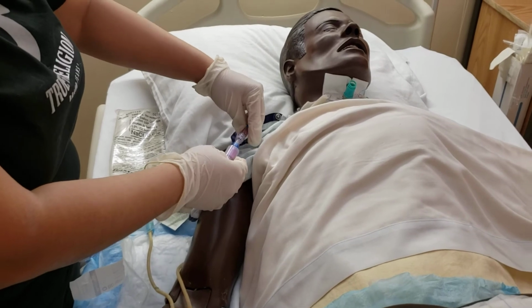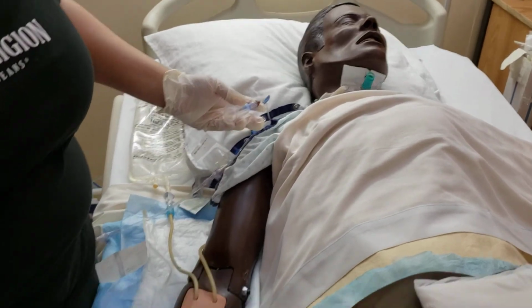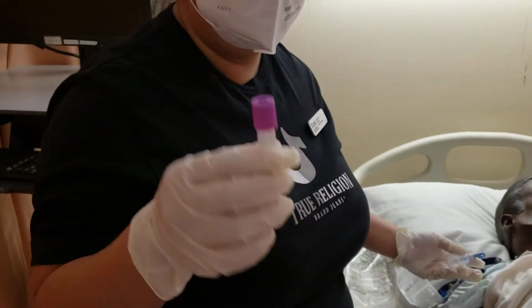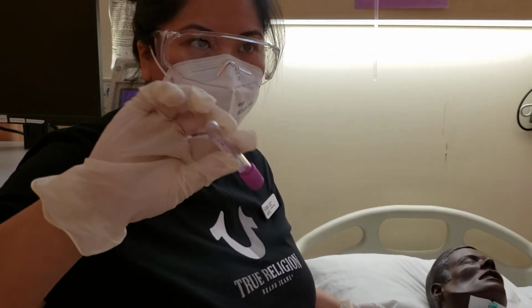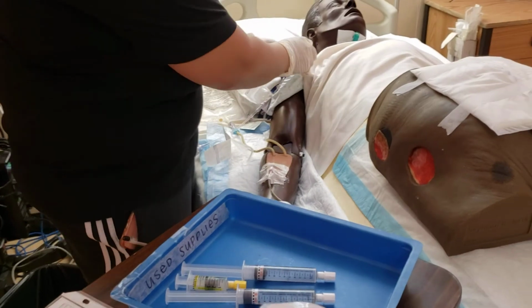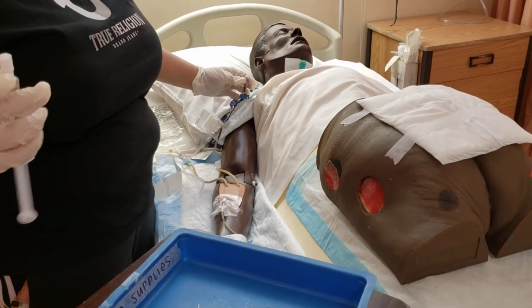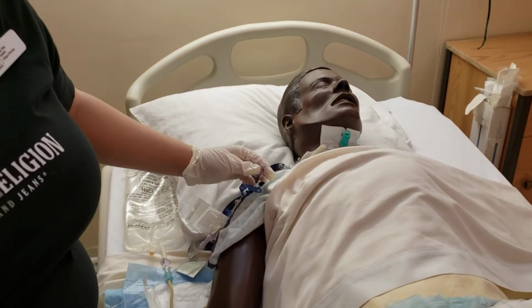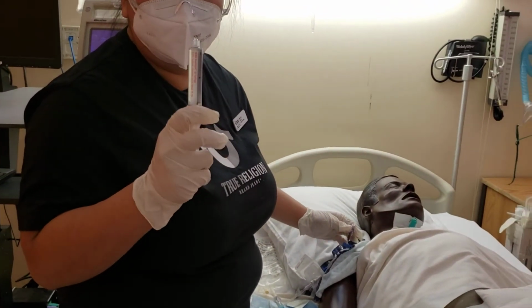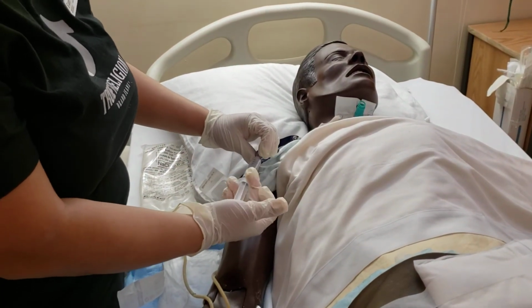I would clamp my line and remove my blood tube. And then as per the inversion guide, we need to invert it 5 to 10 times. So that's 1, 2, 3, 4, 5. And then we'll set that aside for now. We will remove our vacutainer, and then we will flush with our normal saline. We would get rid of the air bubble first. And then we'll connect that. And then instill.